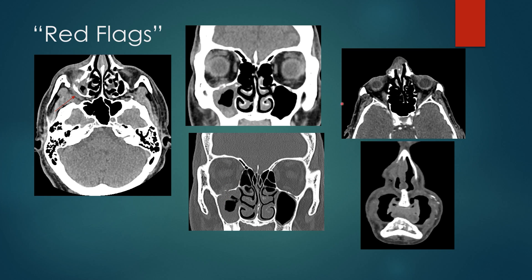In the nasal cavity, look for bone destruction. Here you can see the nasal bone is present on one side, but on the right side soft tissue is present with the bone absent — and on the coronal view there is disruption of the bone. Destruction of the bone suggests a more aggressive process and is a red flag to look for tumor or aggressive infection.